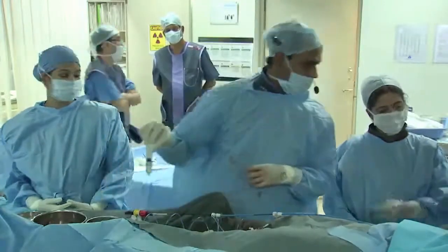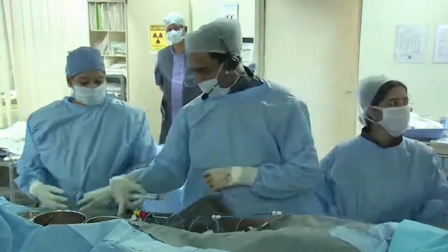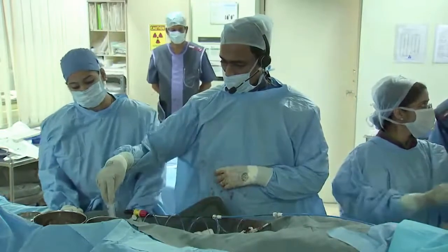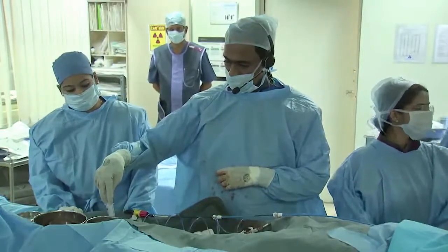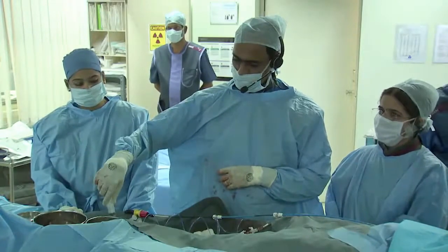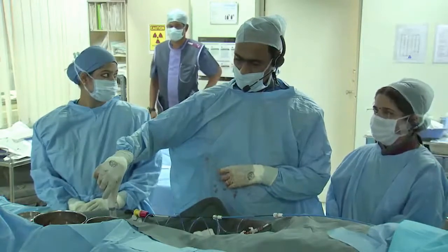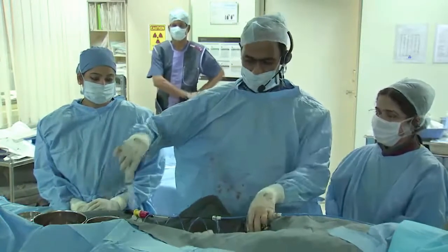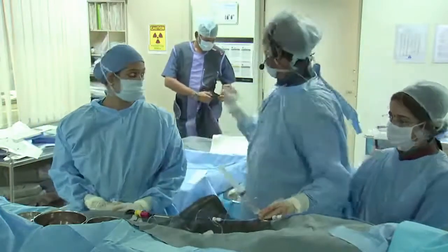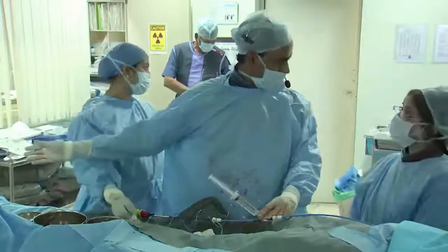This is Nick again. We had this device placed in patients on a compassionate care basis, and we had one patient with left heart problems, and we implanted this around about a year ago. This patient finally ended up having a cardiac transplant as planned, and when the heart was taken out 1 year later, we had the chance to have a look at this device 1 year after implantation. It was a 6 millimeter device, a device with a 6 millimeter hole, and there was ingrowth.